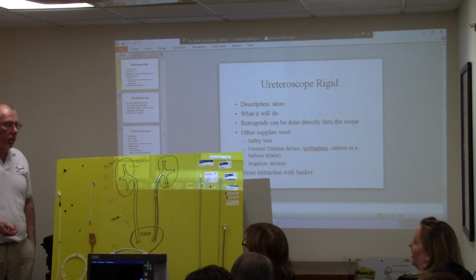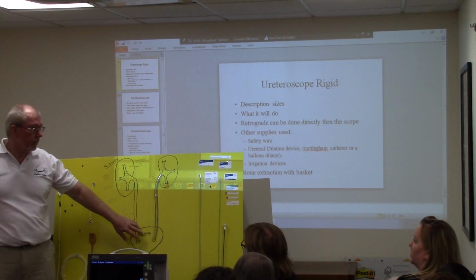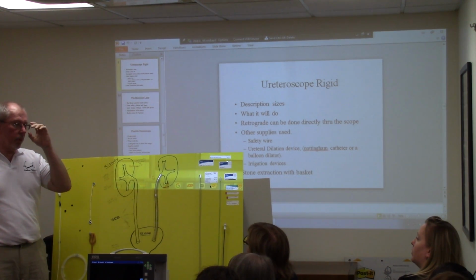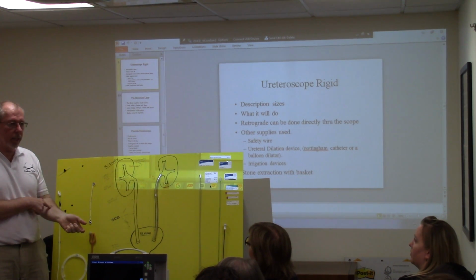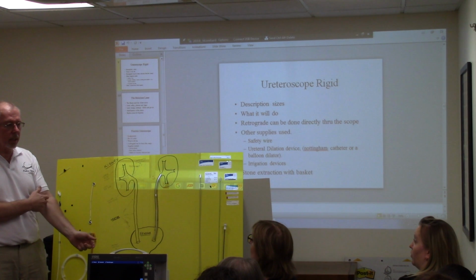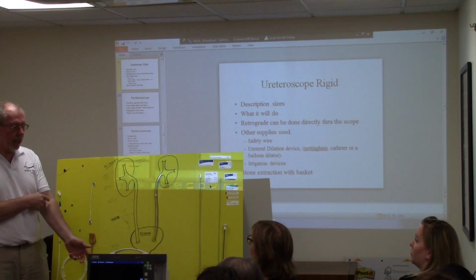What causes the doctor to do an IVP? Can't see a stone. Okay, and like we said, we did retrograde and we couldn't see it either, so they decided to do an IVP, or is it like one or the other? What's the difference? Well, an actual IVP means intravenous pyelogram. So the actual IVP is shooting it into your vein, and that could cause some allergic reactions. So then we use that special dye.